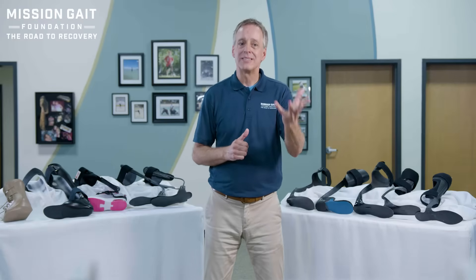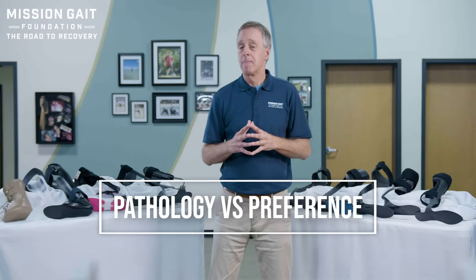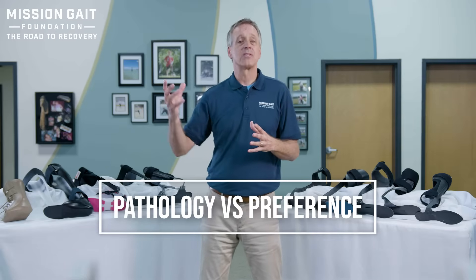With patients, you always need to know both the pathology and the preference of the patient. It's a worthless brace if it's not used. So with every patient, I like to come to them with what I call three brace options: the good, the better, and the best brace.